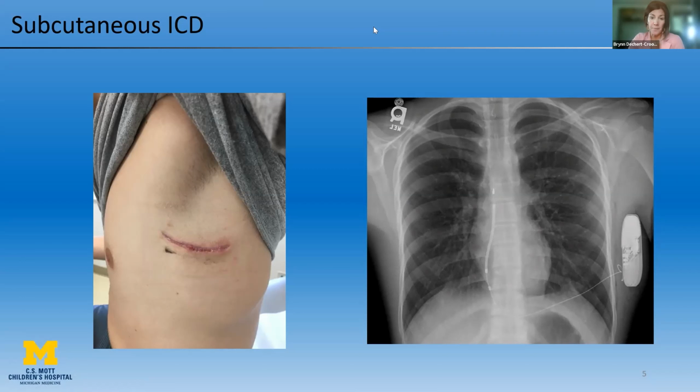And that's the important difference between these two types of ICDs. The lead runs up the sternum, past the xiphoid and almost up to the clavicle area in the center. The shock vector goes from that can, and there are two places that the energy can go to. It can go to that tip, or the secondary, which is the alternate, which is down near the xiphoid area, the center of that X-ray there.